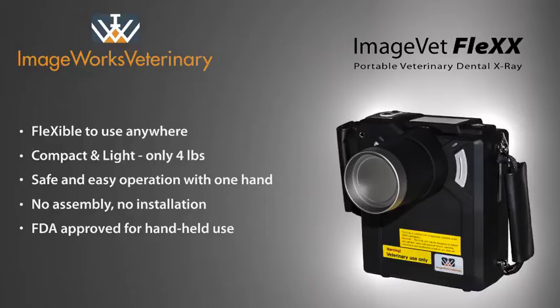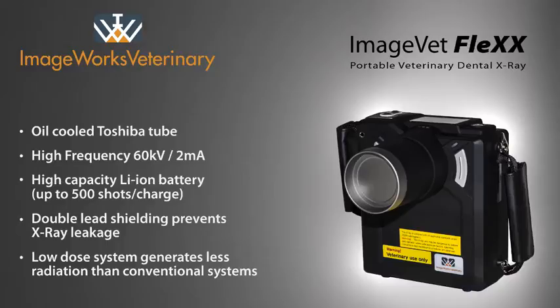The Flex requires no assembly or installation and is FDA approved for handheld use. The unit itself is lightweight at under four pounds. At 60 KV and 2MA, it has the power to produce superior image quality on even the largest patients.